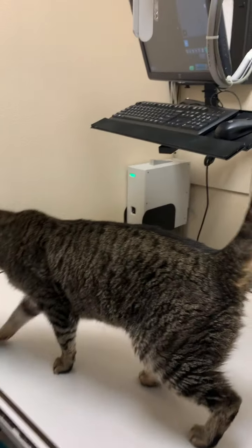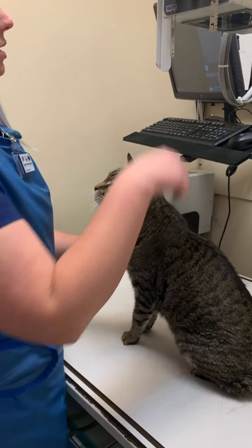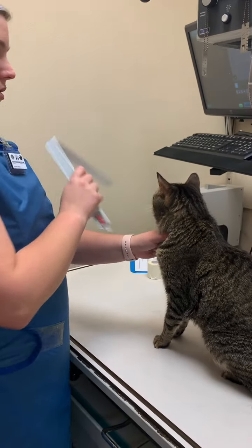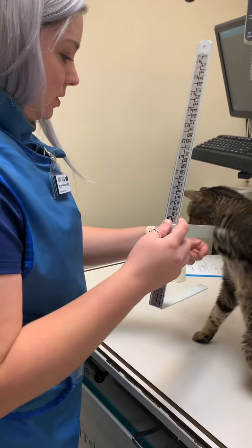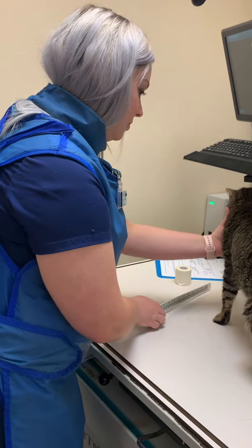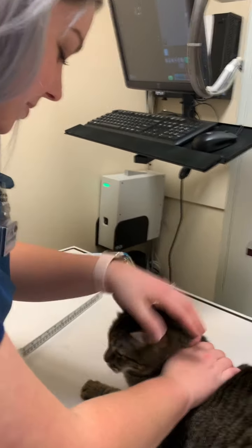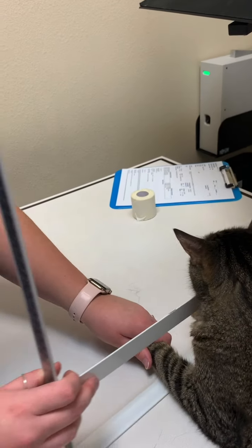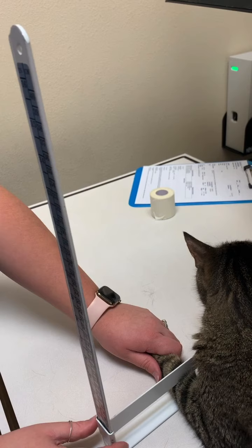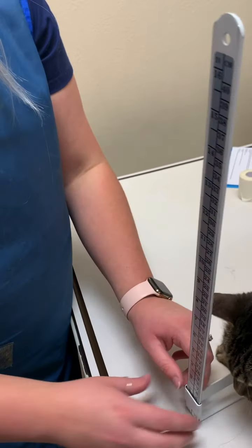So you want to measure at the mid shaft of the radius and between the radius and the ulna. Okay, and it's measuring at a 2 on the caliper.